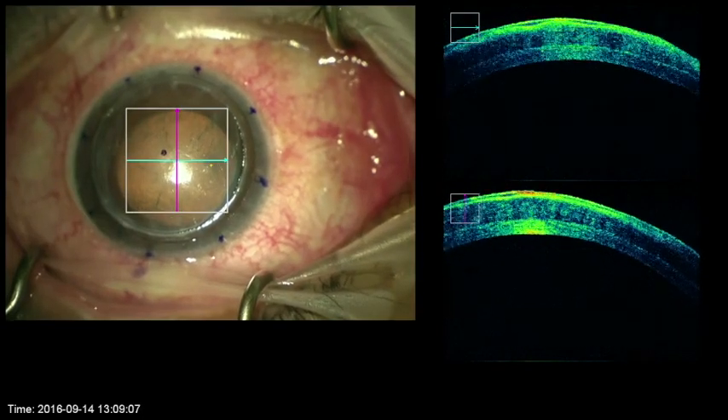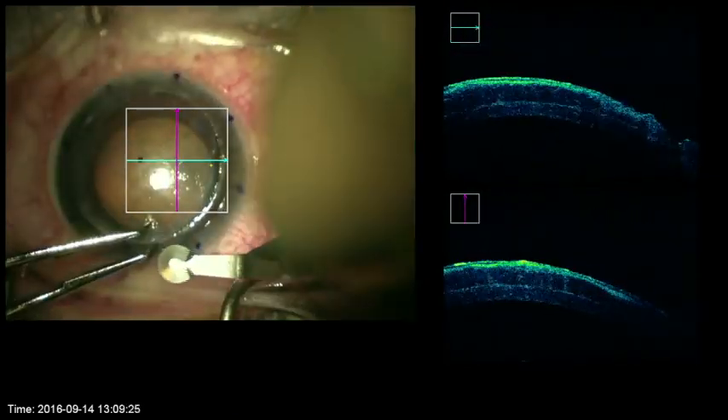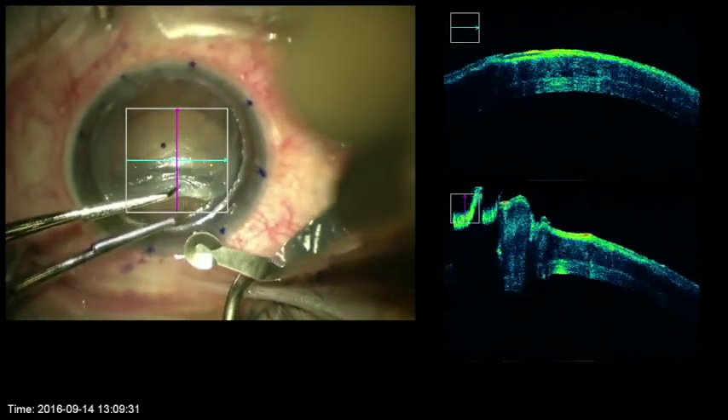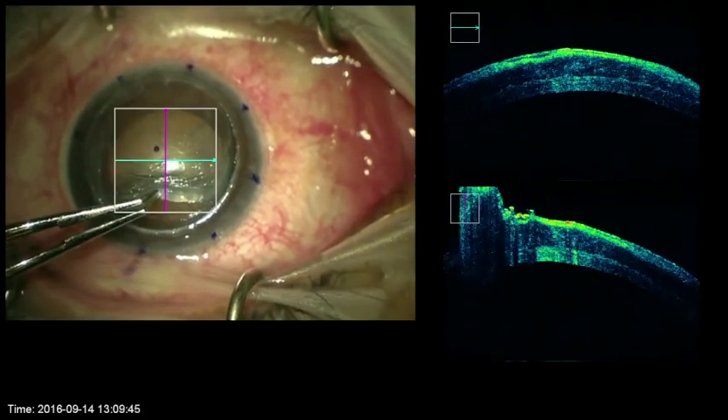Here, poor epithelial healing resulted in anterior stromal haze requiring repeat grafting. The layers are clearly visible and removal of the anterior cap does not require sharp dissection. The OCT nicely shows the separation of the layers.